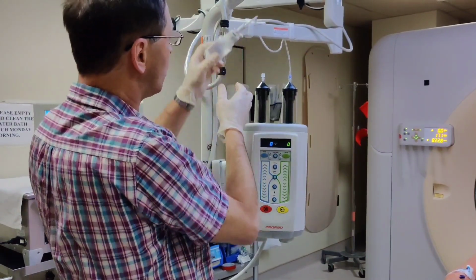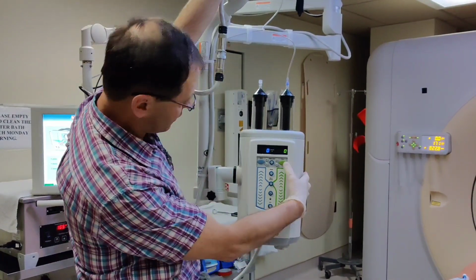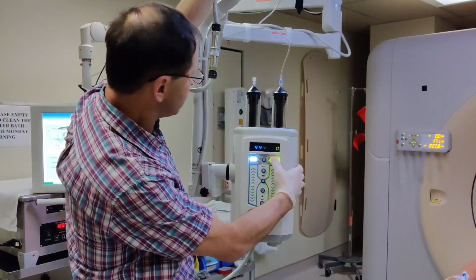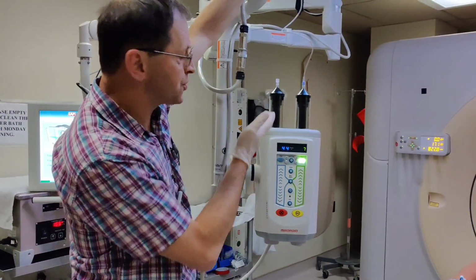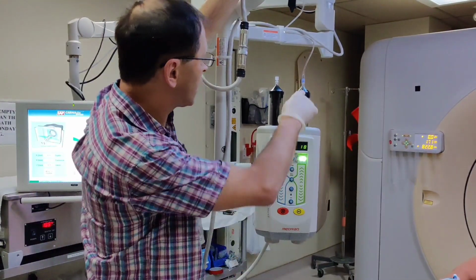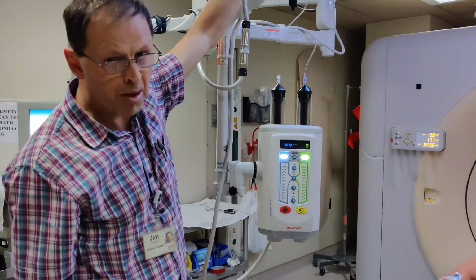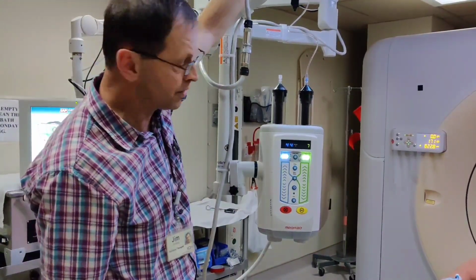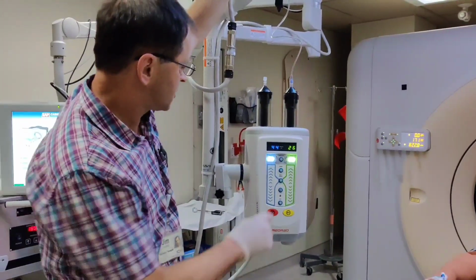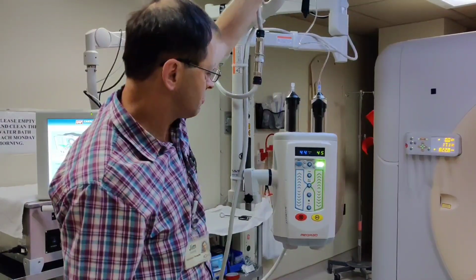I'm going to hold the bottle up above to let gravity work in our favor. And then I'm going to select fill A, or sorry, auto load, and then fill A. What you're going to see is the plunger is going to come down a bit, draw in some contrast, and then it's going to push that all back out to get rid of the air here. And then it's going to draw in the preset amount. As you remember from the protocol I selected, it was 70 mils. So it's slowly starting to draw that contrast back into the syringe.